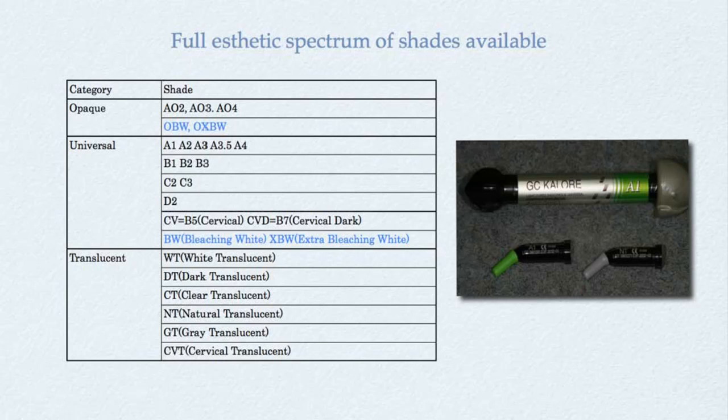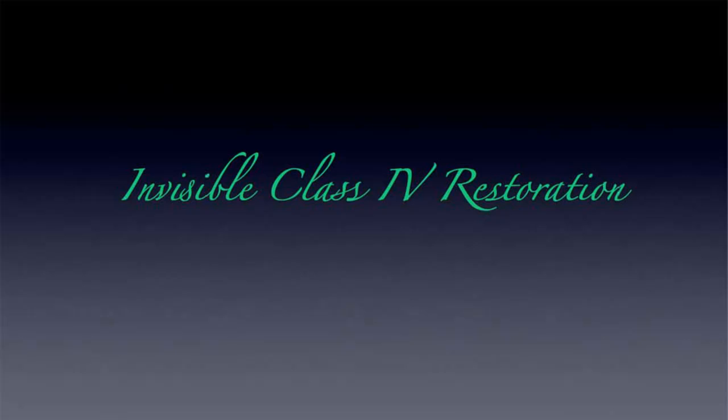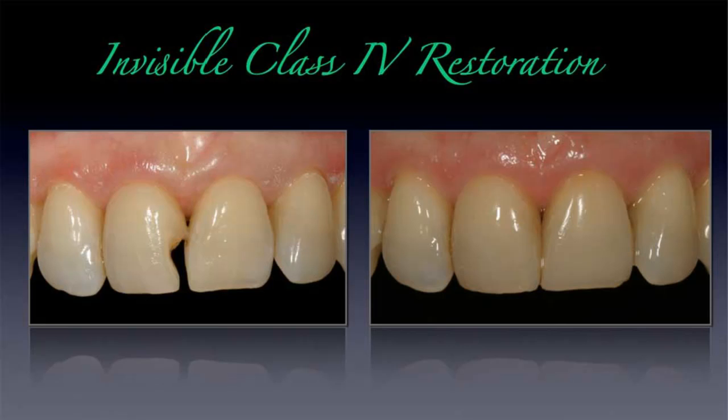This is a 46-year-old female who presents with a failing composite resin, as you can see on the right central incisor, and the other central incisor is what we call lingual angled or linguoverted. And so what she wants to do is to replace this composite here and to have the 2 teeth become more in line with each other. And so that's the objective.